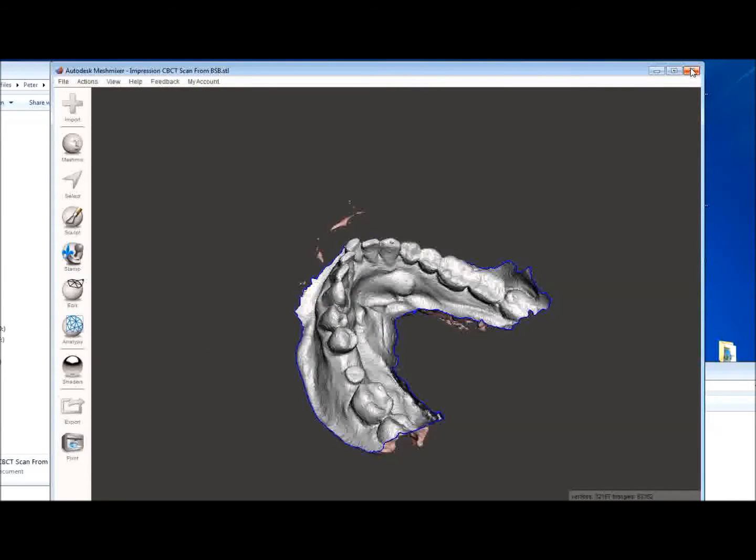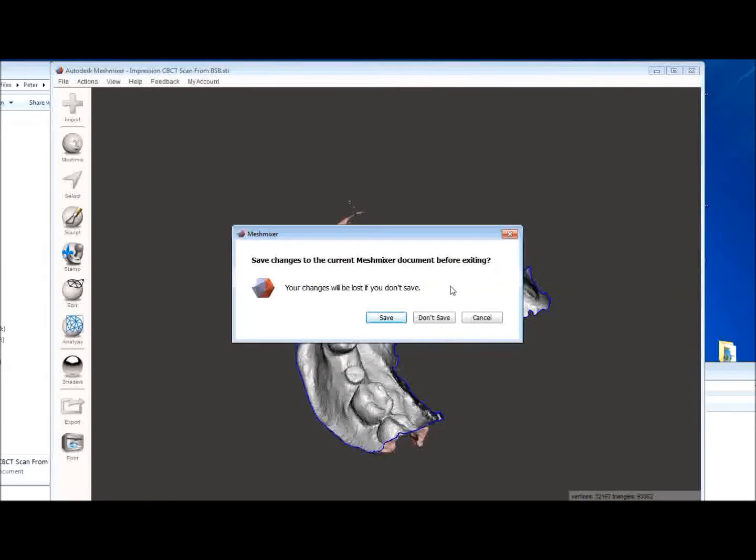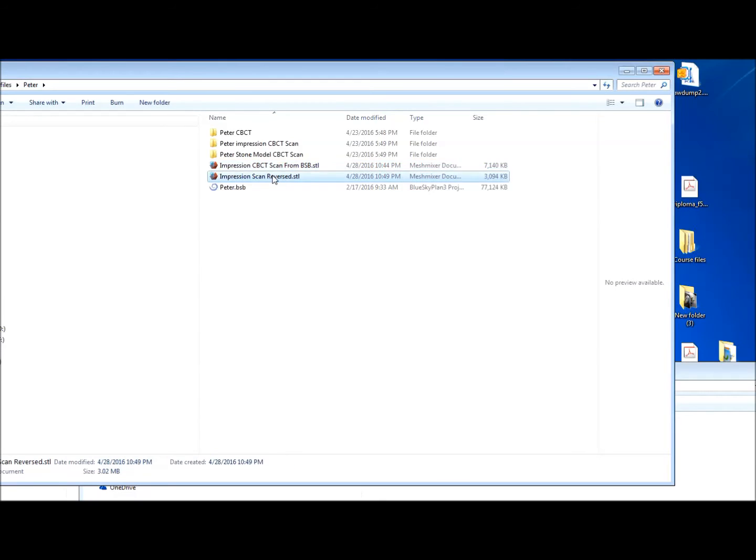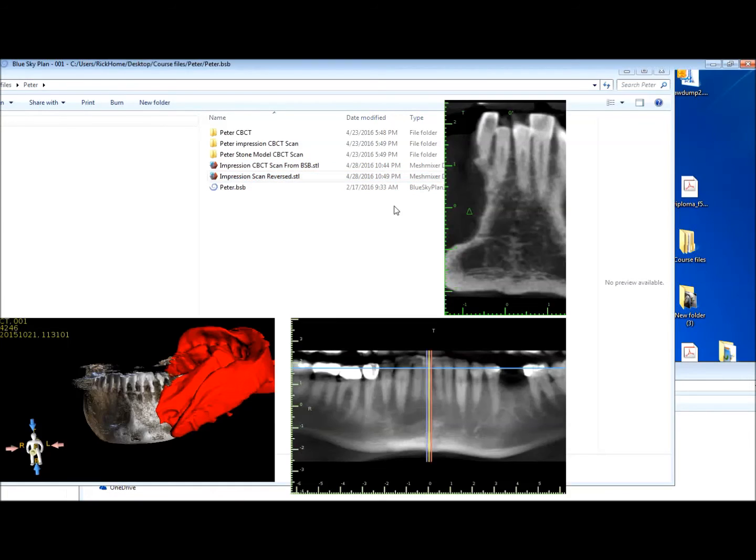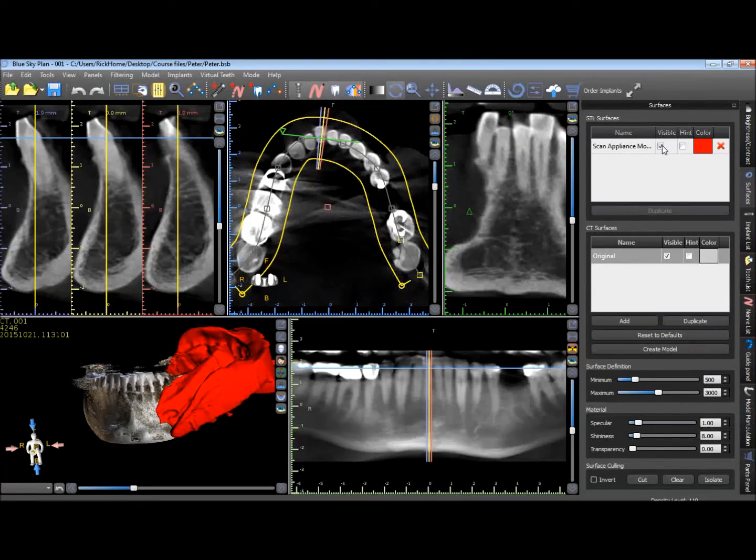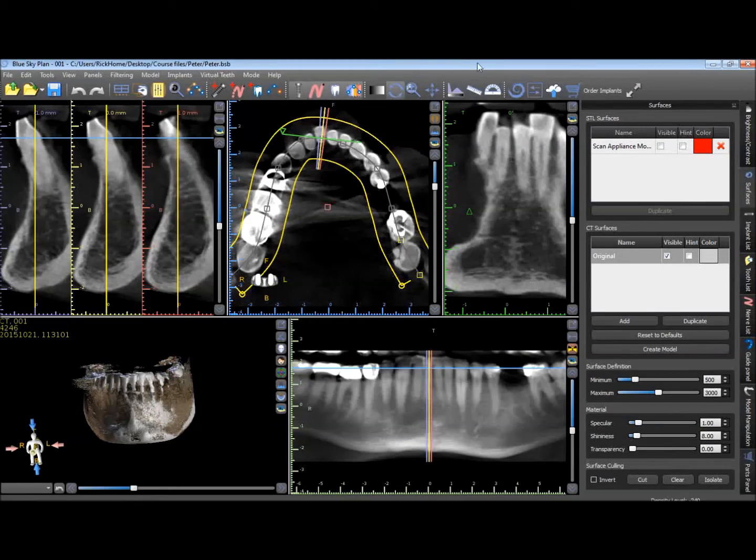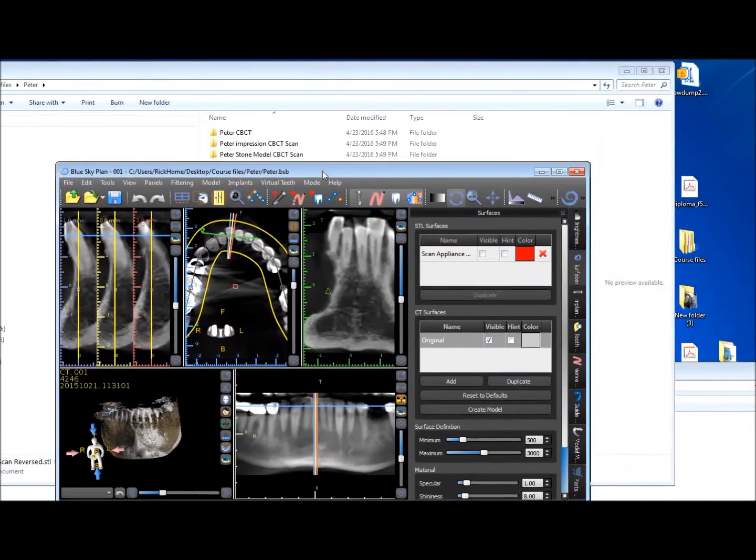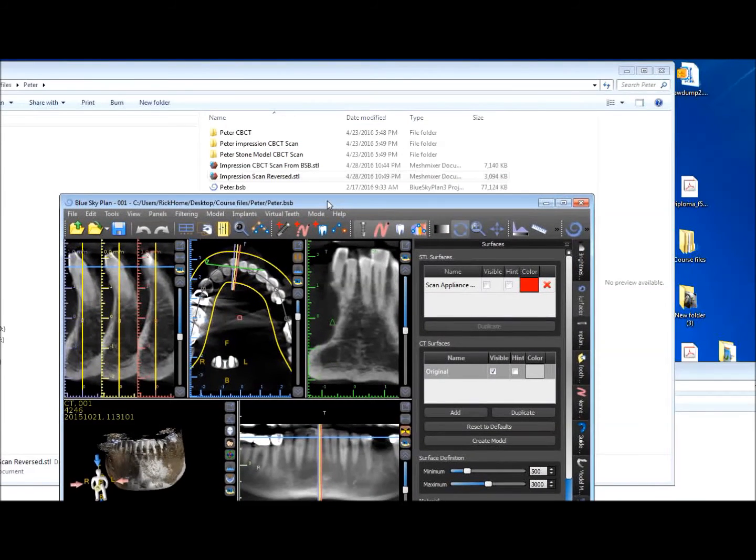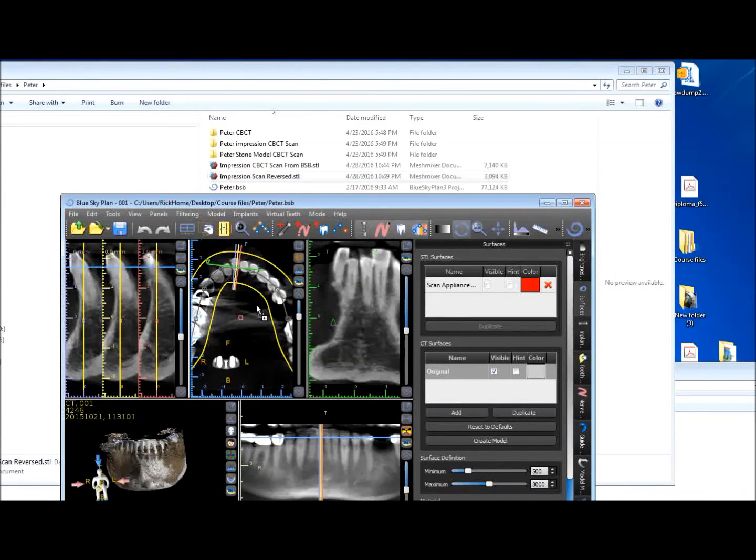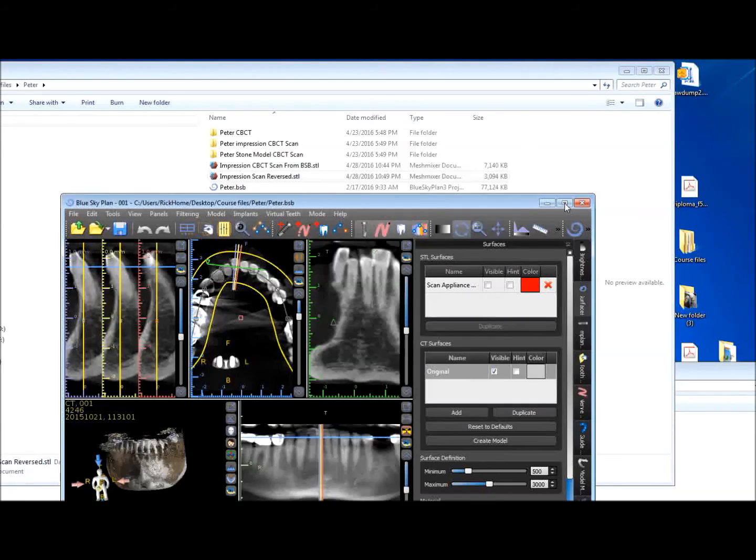We can now close Mesh Mixer. We're not going to save the Mesh Mixer file, it's already saved as an STL. And then we can now bring this back. We're going to get rid of the scan appliance model. That was the original one we brought in as a DICOM. And we can now bring this impression scan reversed into the Blue Sky software.